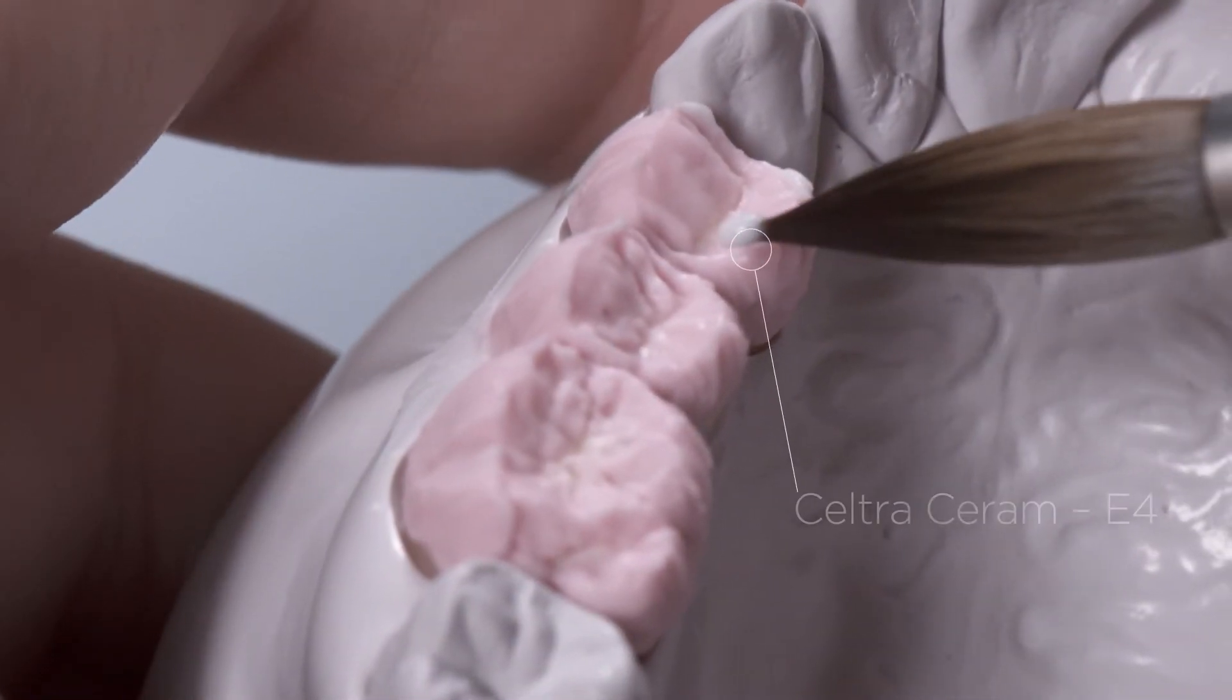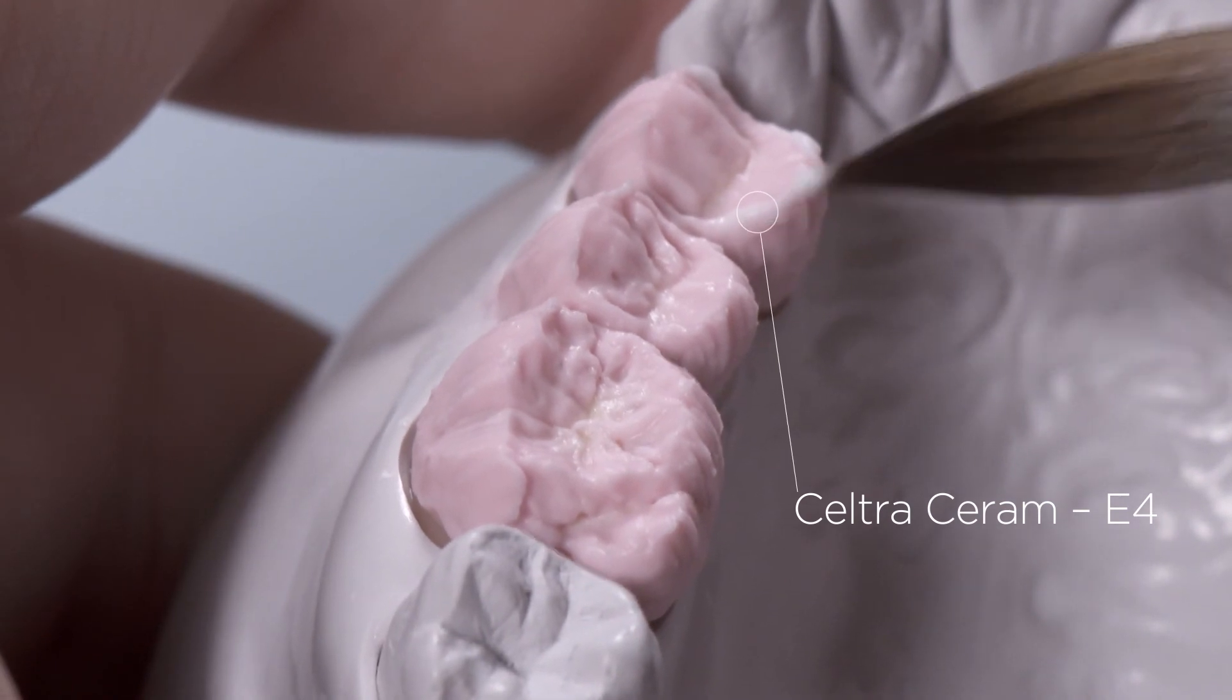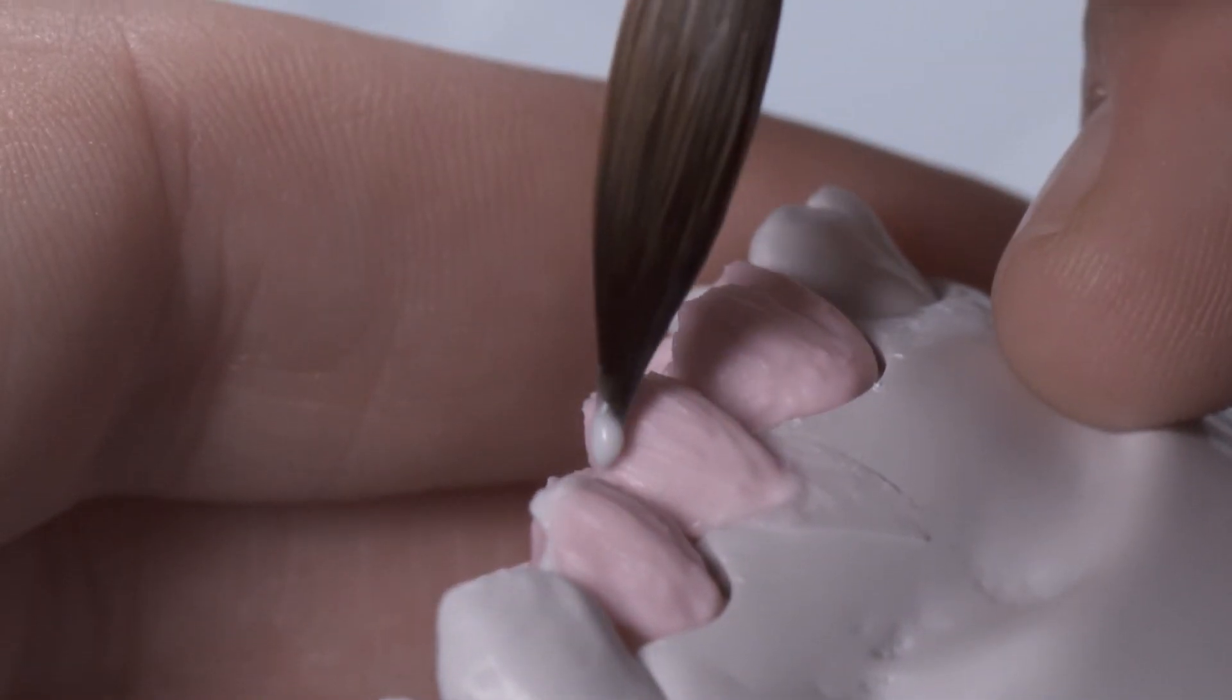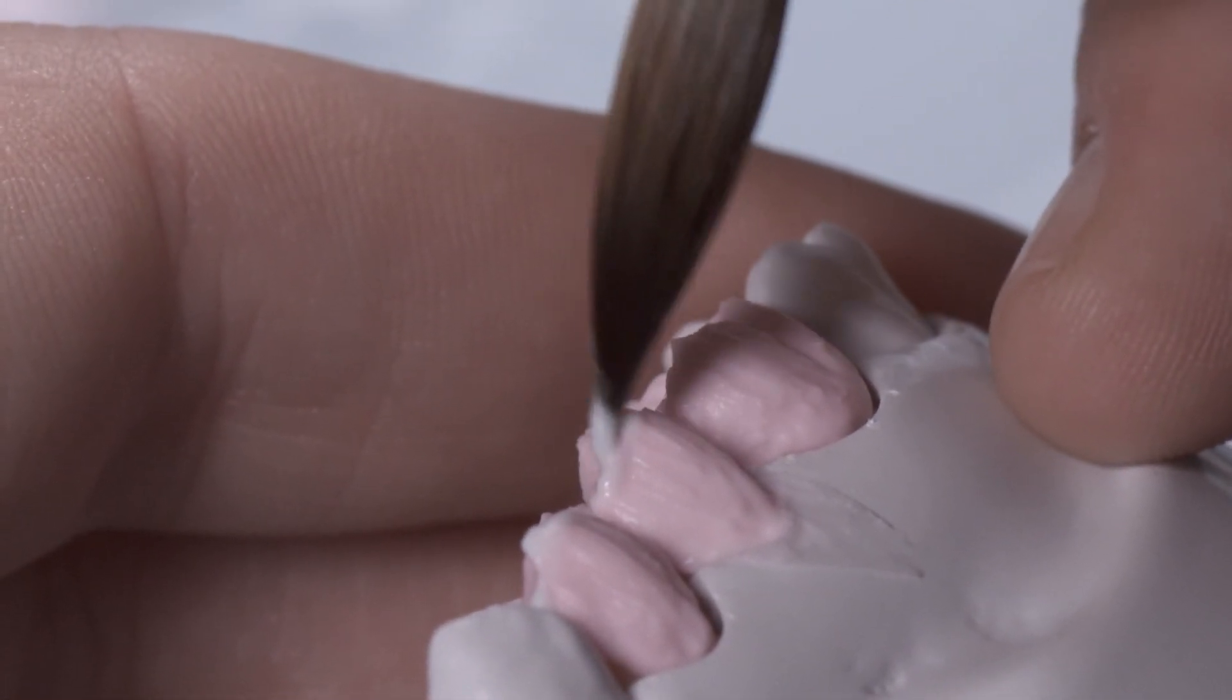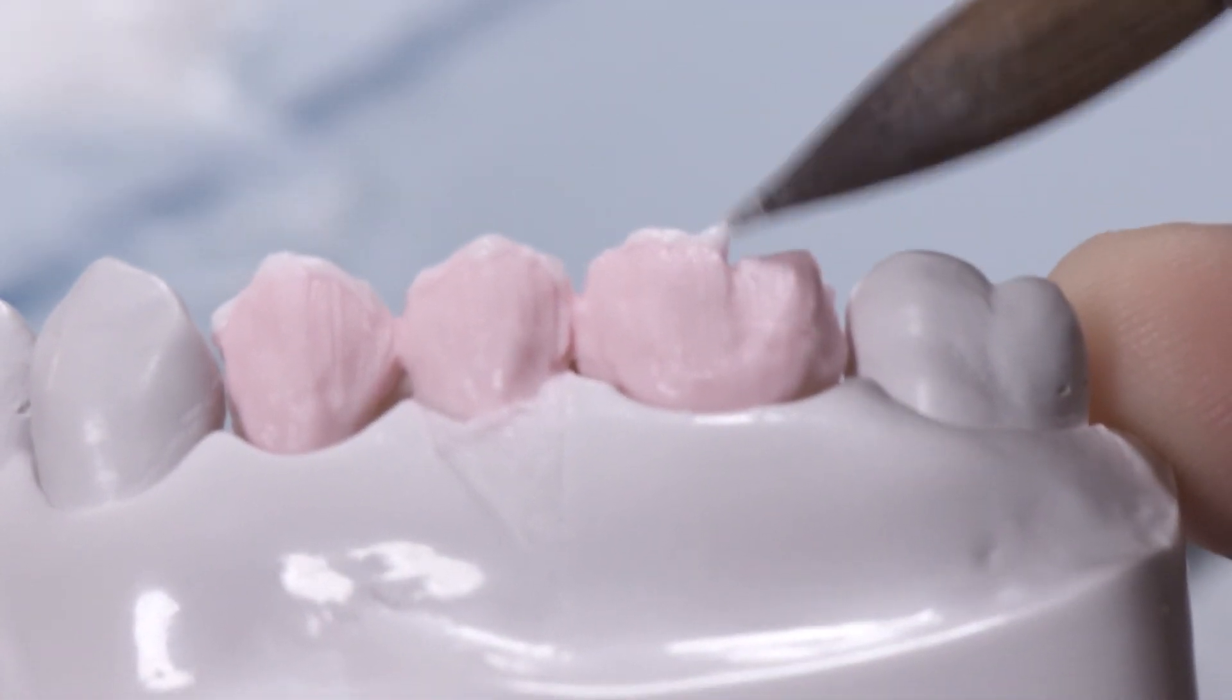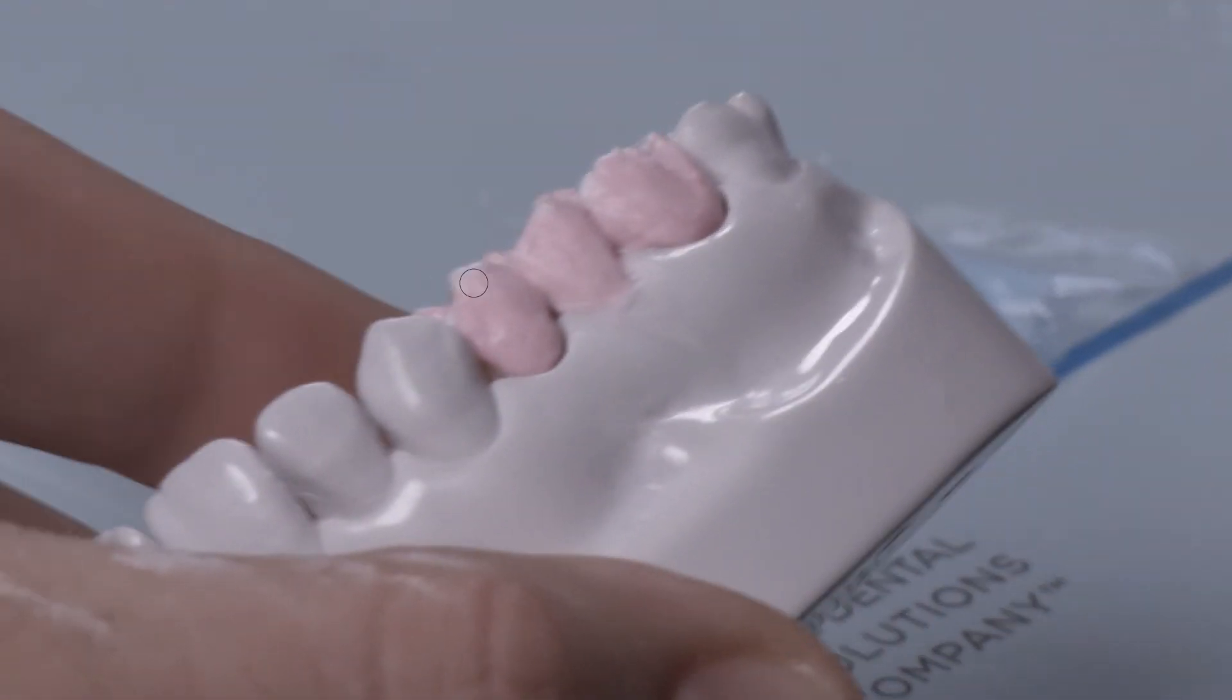The ridges of the occlusal surfaces are emphasized with Seltra Ceram Enamel E4. This makes the occlusal surfaces appear extra vivid in the most translucent areas. Complete the build up with Enamel E1.